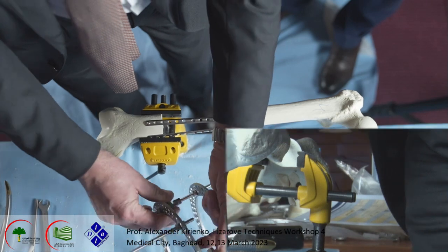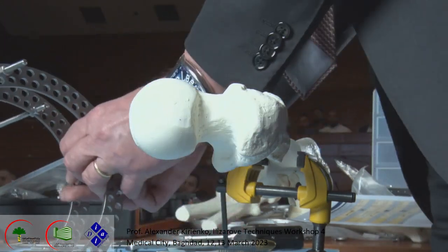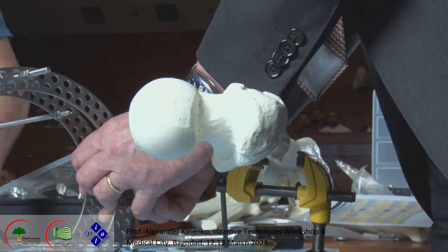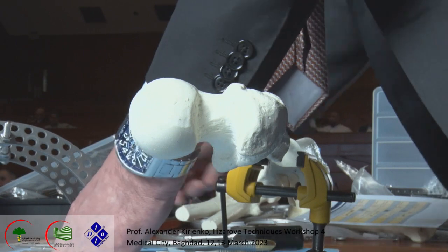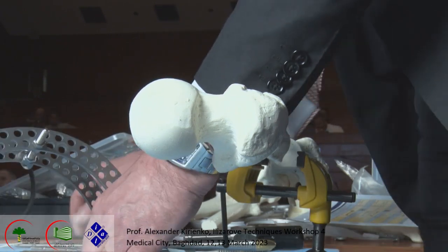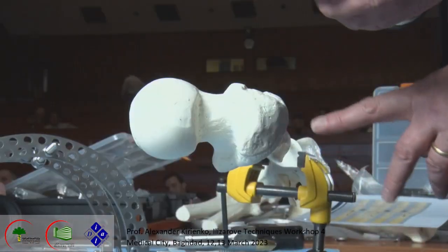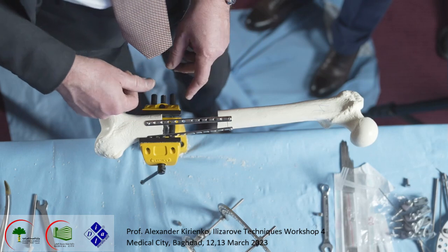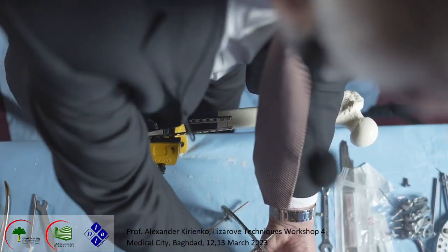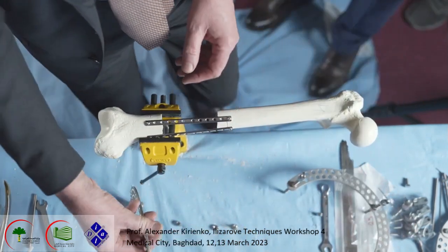What we do now, okay, I have prepared this system. And I start the job with the half pin. I put the half pin on the mid shaft, on the diaphysis of the femur. Okay.